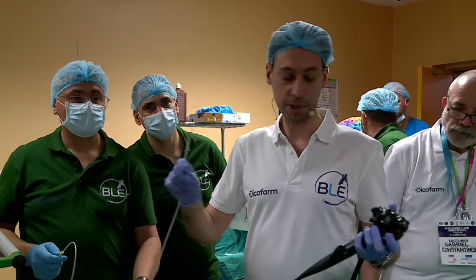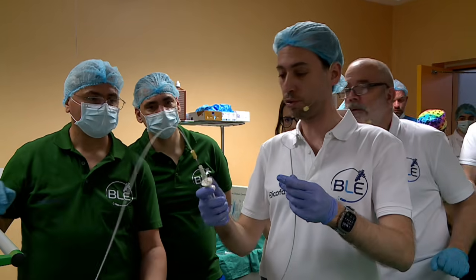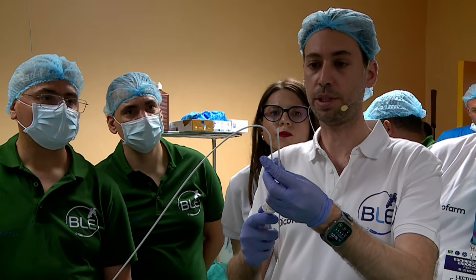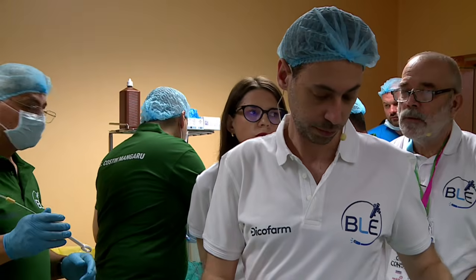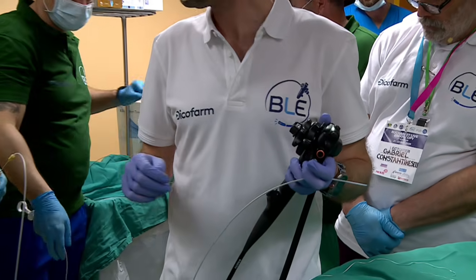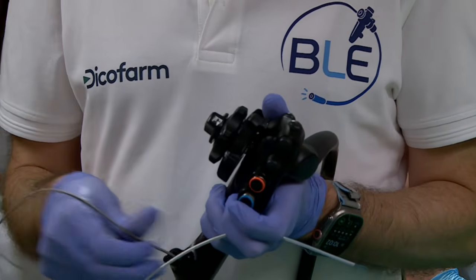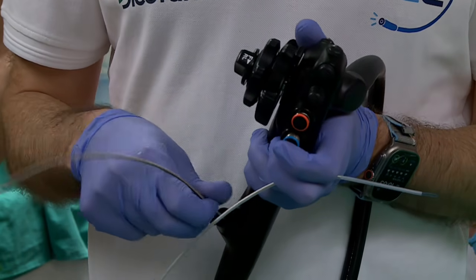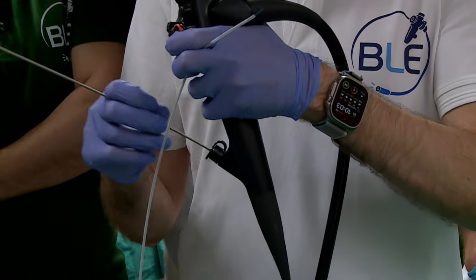So here is the endoloop. It is very important that you know how to use it. We will close it partially like this, and please give me a clip. So I will advance the endoloop over the scope. Please, the camera focus on my endoloop.